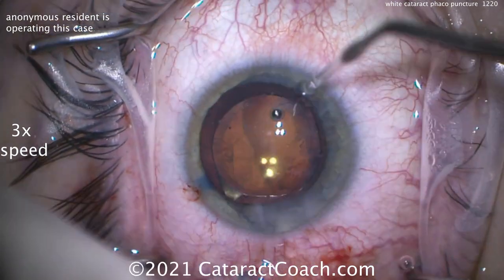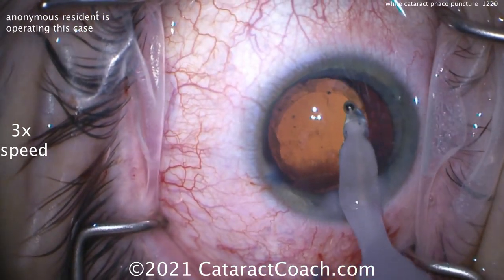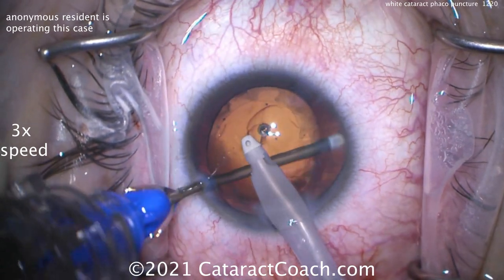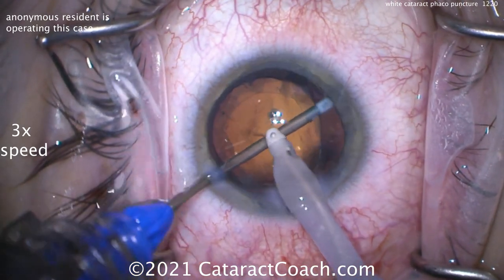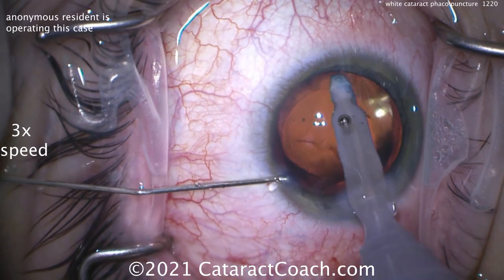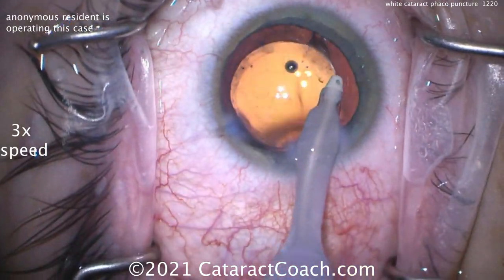If you don't get it, get the cystotome back again and nick it a little bit more — just get a little nick in the capsule is all you need so you can grab it. The rhexis can be enlarged to an appropriate size. There it is — much better. Now we've got a nice reasonable capsulorhexis to overlap that optic. It looks pretty clean. Don't go crazy trying to really polish the heck out of the capsular bag. Get as much cortex as you can, obviously — we want to minimize the inflammatory load in the post-op period. But with these types of intumescent cataracts, oftentimes the capsule is scarred up and you're unable to fully remove it. Try your best, polish up and get as much as you can, but don't damage the tissues.